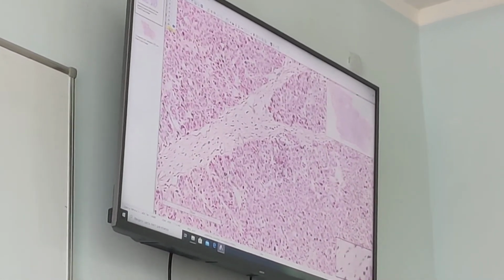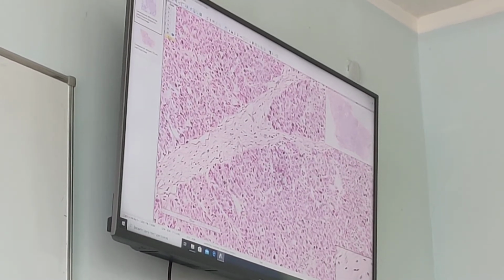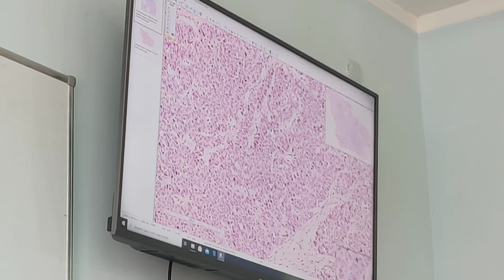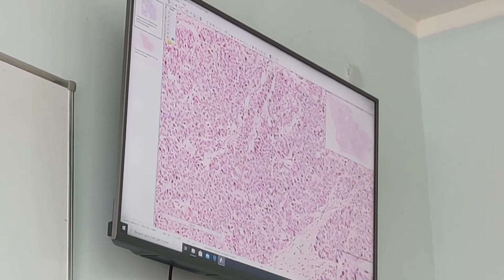You can ask me why you told me about fields, but what is it? This is connective tissue. It's the stroma of the tumor. And the parenchyma is represented by a whole mass of atypical cells.